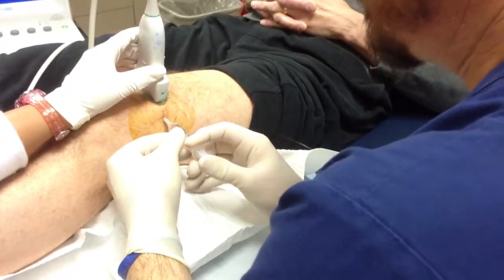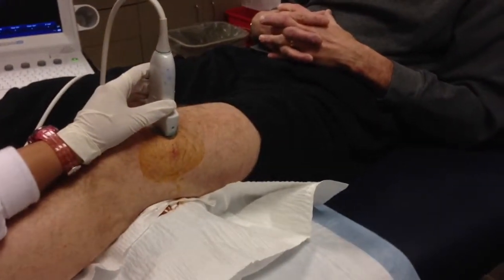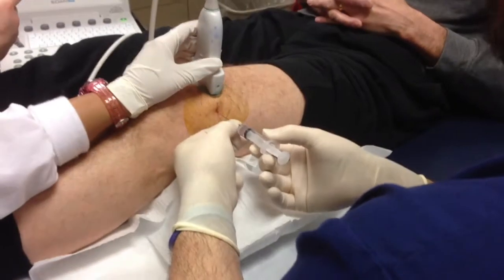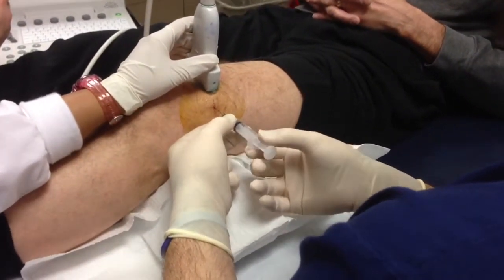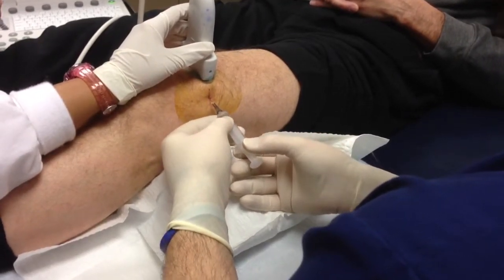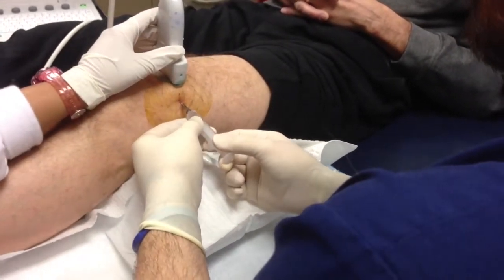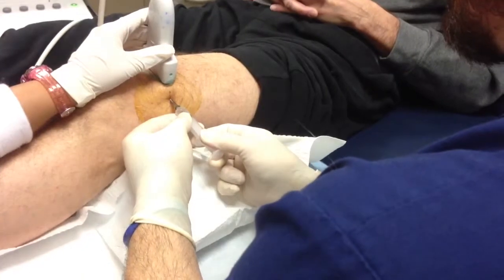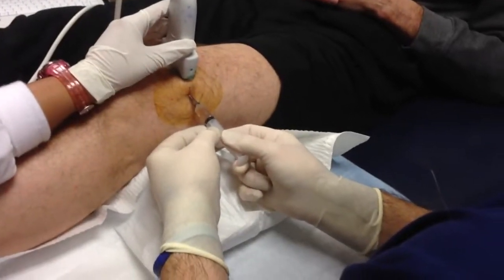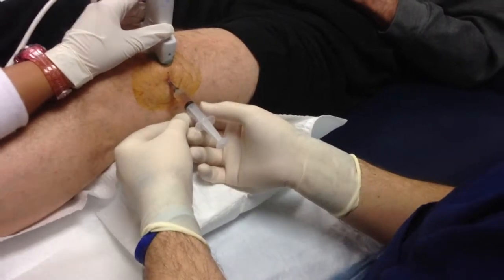Now I'm injecting through the 27-gauge needle, which is just local. Now I'm going to change over to the 22-gauge. Usually with the 27 it's hard to actually pull back any synovial fluid because of the viscosity. I'm trying to go down the exact same track. There's the needle again — you can see it looks a little bit magnified from the 27. Now you can see in the syringe there's actually synovial fluid entering, which is an even more positive sign that we're in the right spot.